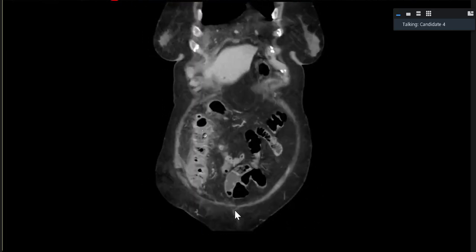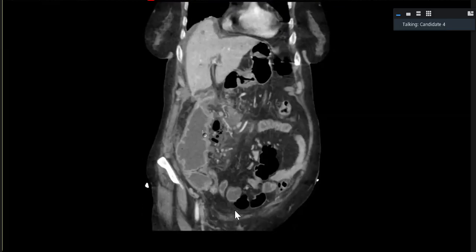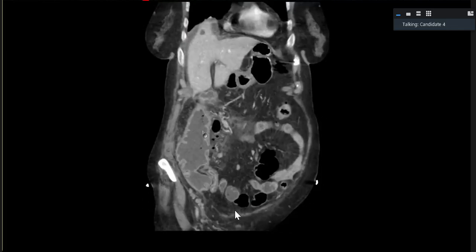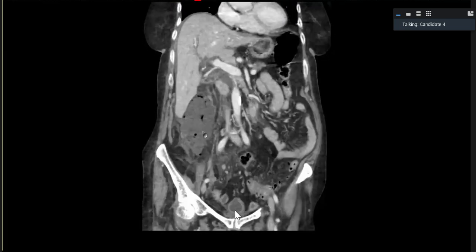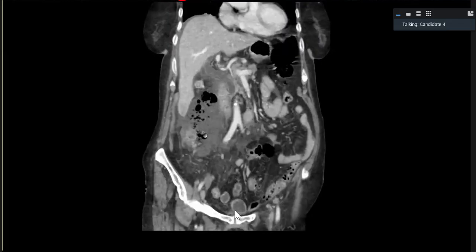So, in conclusion, I am concerned about the infective disease process, which is involving the whole of the ascending colon with stricture narrowing at the hepatic flexure and possibility some perforation occurred at this site, maybe due to the complicated diverticulosis, and there is an abscess formation in the abdomen.